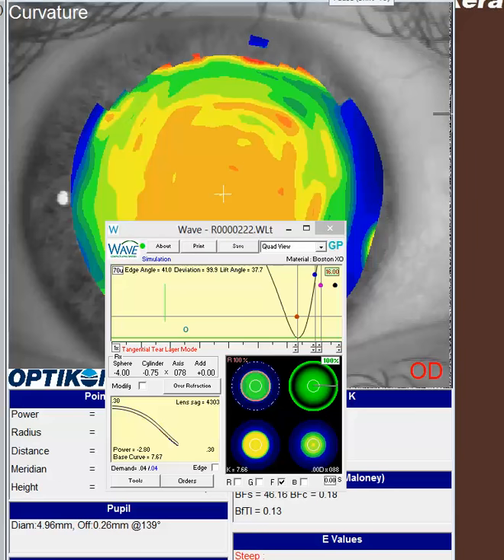I see from your clinical request you have a patient who has slightly larger than average pupils, and you're running into some glare issues. For this case, you didn't quite specify, but I'm assuming you mean glare mainly in poor lighting, as opposed to just glare in general from being out and about. And we'll talk a little bit about the two of those.